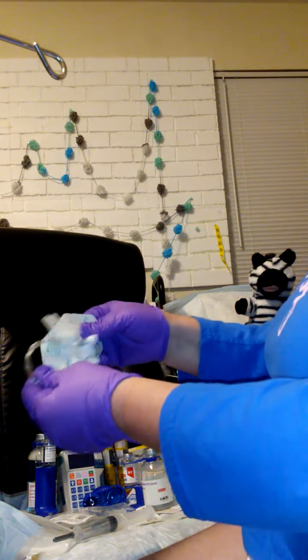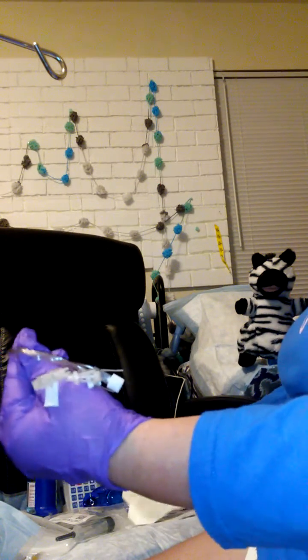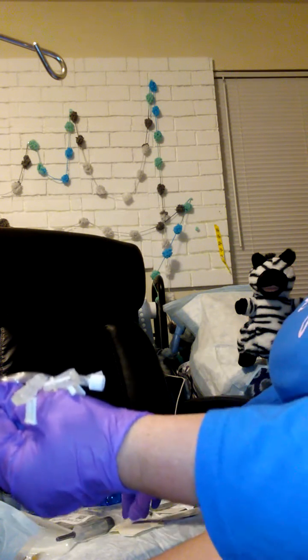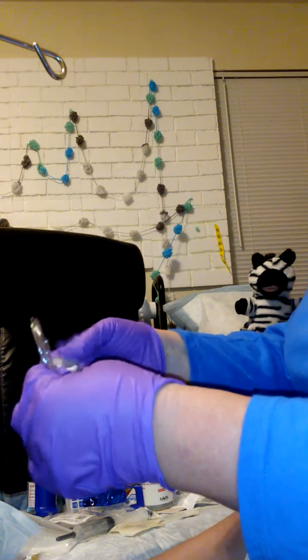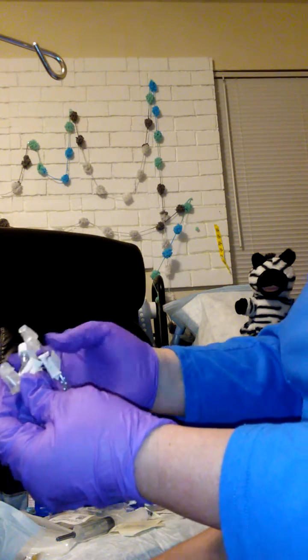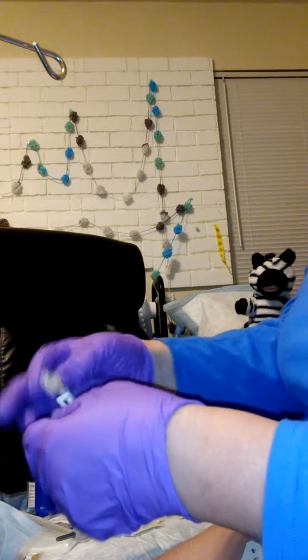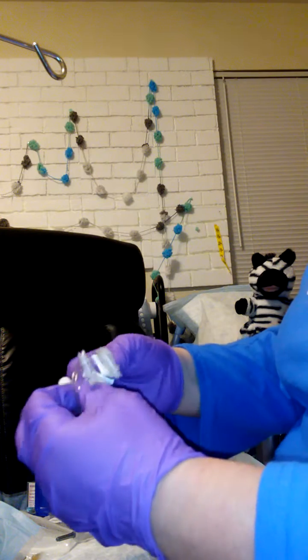So move this bag. This is the needles. I use 2 needles. These are the Tegaderms that come with this to secure the needles in your skin. The butterfly, they call these butterflies. But we're going to go ahead and sort this out really quick so we can see what's happening here. Do it as quick as reasonably possible.